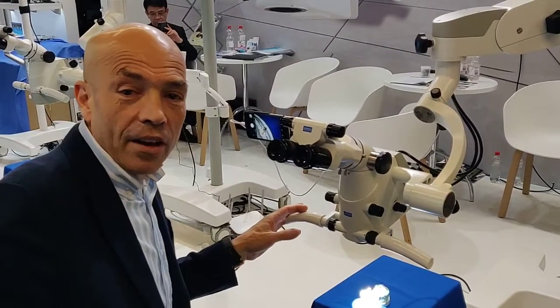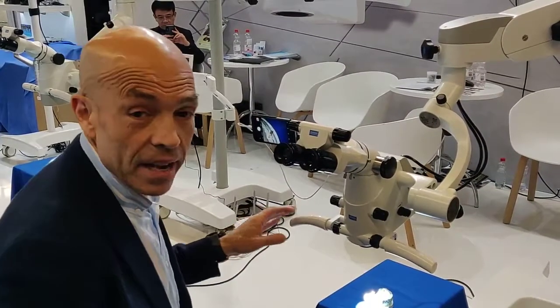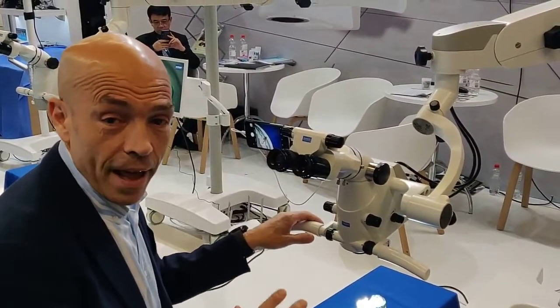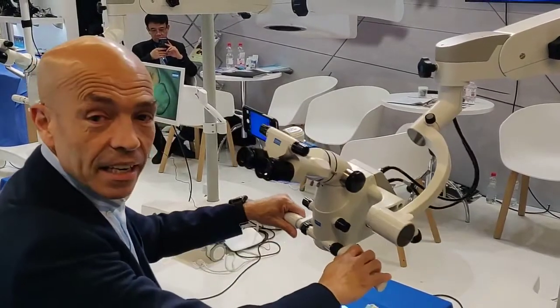Hello. This is a new microscope from Zumax. The model is 2380. The great thing that this microscope has, which is outstanding and quite unique, is the handling of the microscope.